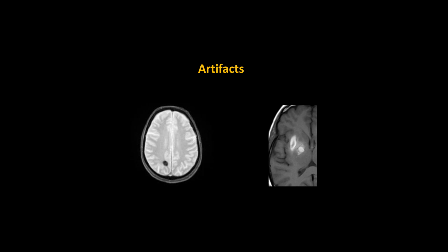Just as a clarification point, alignment with their IRB language. Another term that they're sort of used as is incidental finding. Incidental finding, yes. The first ones you showed, you don't need to talk to the IRB about. These ones, right, exactly. And be familiar with what the protocol is at your scan center.